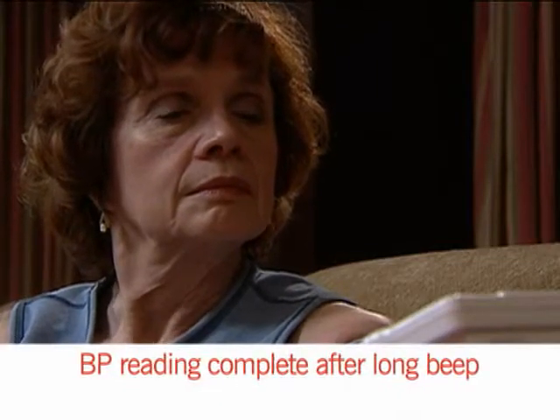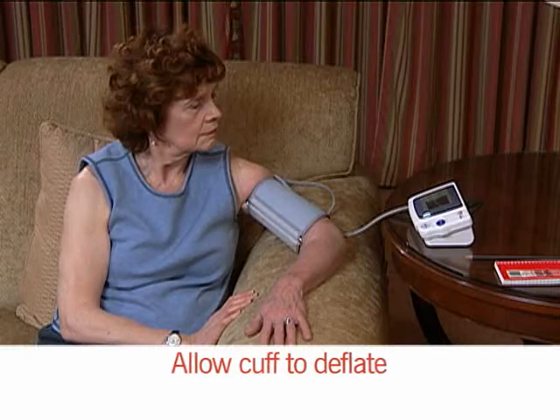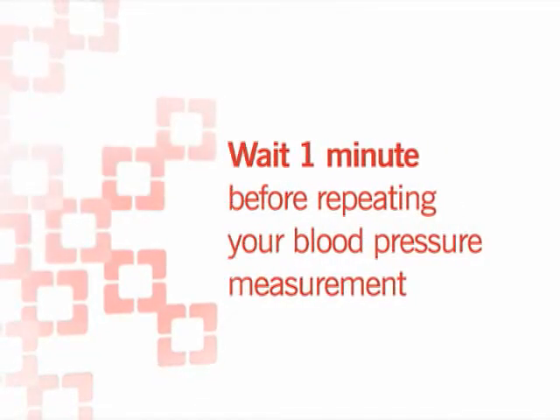Wait for a long beep. This means that the measurement is complete. Note the pressures on the display screen. Allow the cuff to deflate. If you did not get an accurate reading, do not inflate the cuff right away. Wait 1 minute before repeating the measurement. Start by reapplying the cuff.